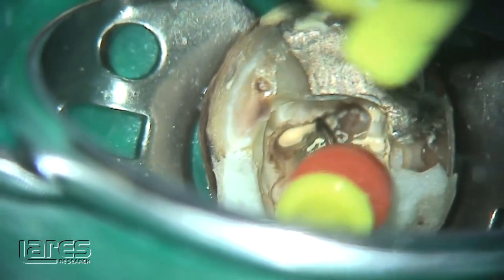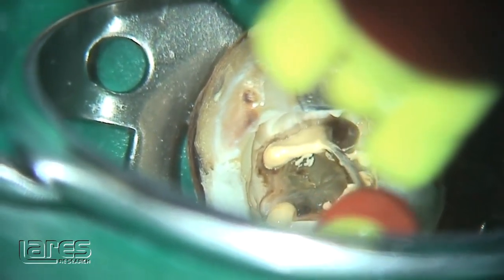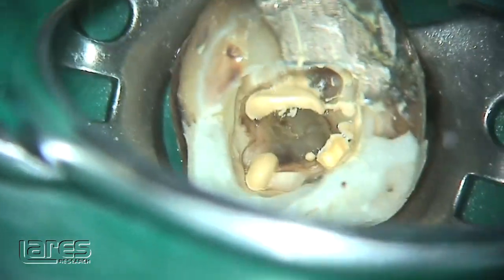This is routine now. If I don't get this, I'm a little worried that I haven't got the system cleaned out properly. Notice I don't say root canal — I say system, because it's a system, and I want to clean that out totally in three dimensions.